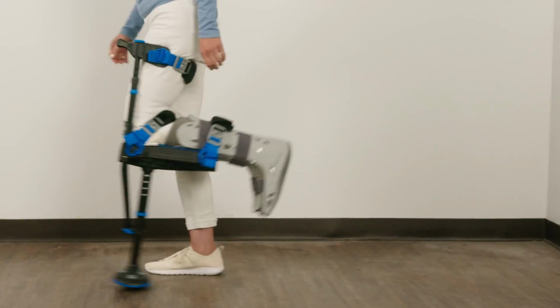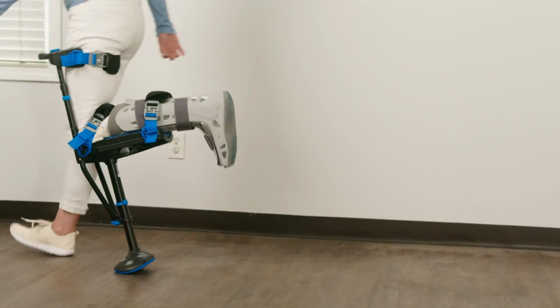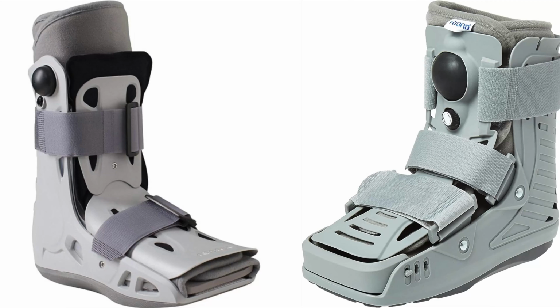Casts and boots. The iWALK can be used with most casts or boots. Some may require some simple modifications. If you're using an air boot, make sure that the pump is located on the side of the boot. If located on the front of the boot, it will pump with each step on the iWALK. If you must use this type of boot, you will need to disable the pump mechanism.